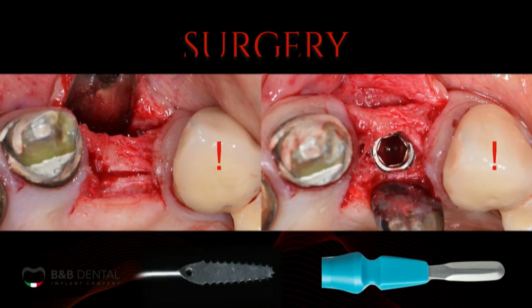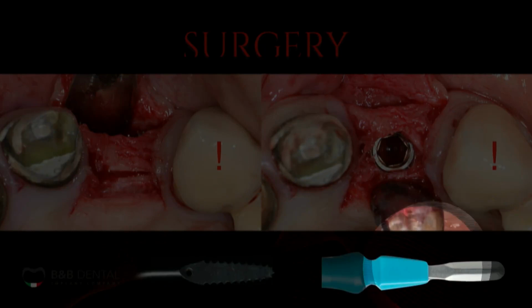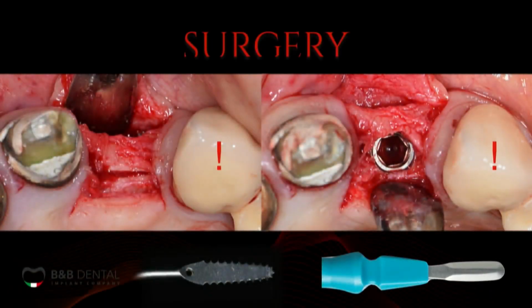In this case, I use some tools, for example the piezo surgery, the beaver blade, or chisels to initially separate the two bone plates.